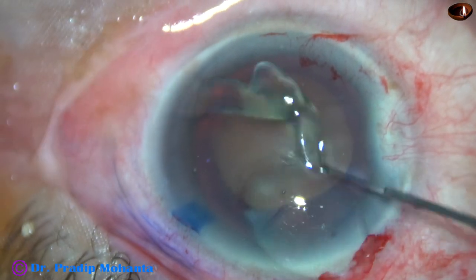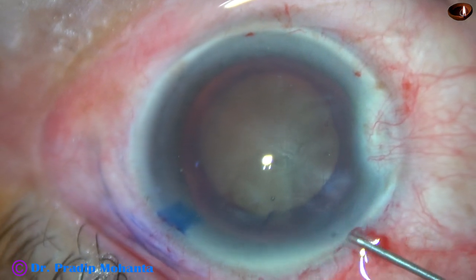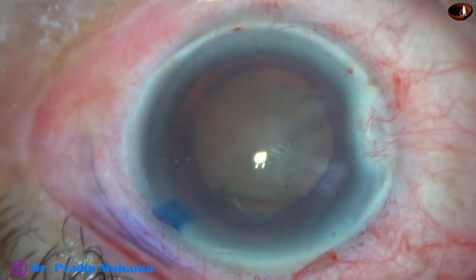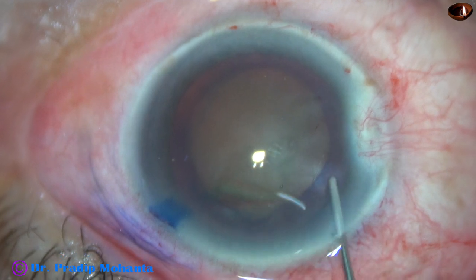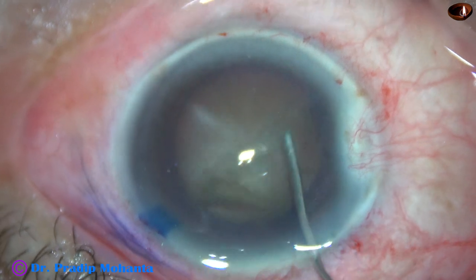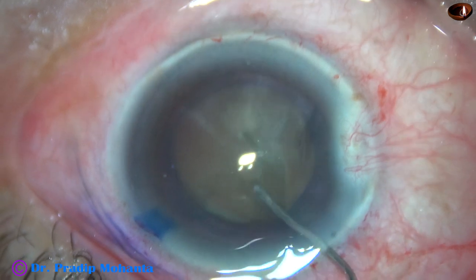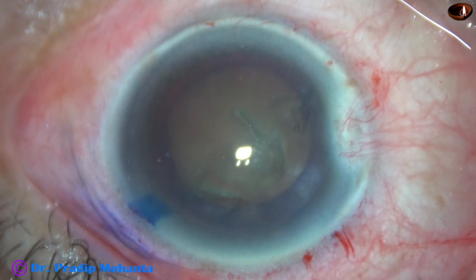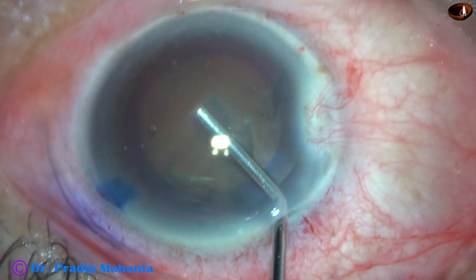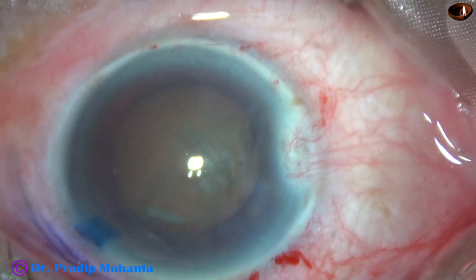We can see that the cataract is quite hard — nuclear sclerosis is about grade 5. At this moment I am going to do hydrodissection before injecting fluid. Some VISCO is expressed out. You must remember that all the wounds are very small in size, and there should not be any fluid buildup. If there is fluid buildup, it may cause blowout rupture of the posterior capsule. Hydrodissection has been done.